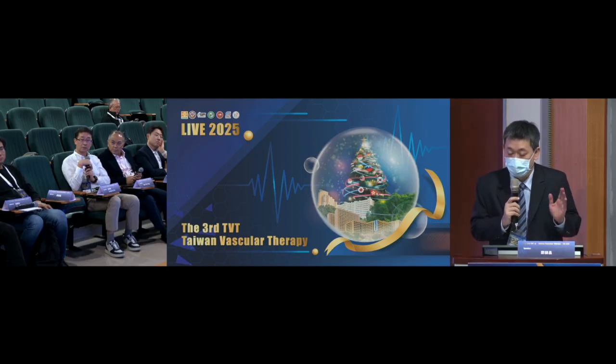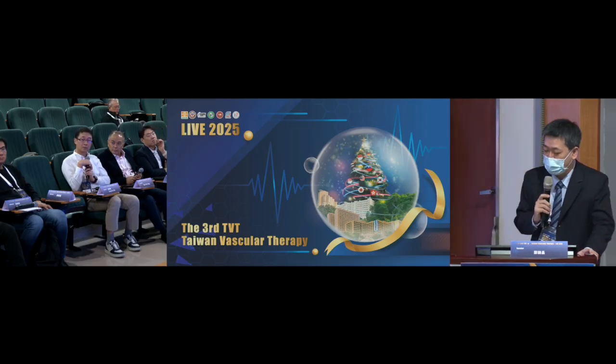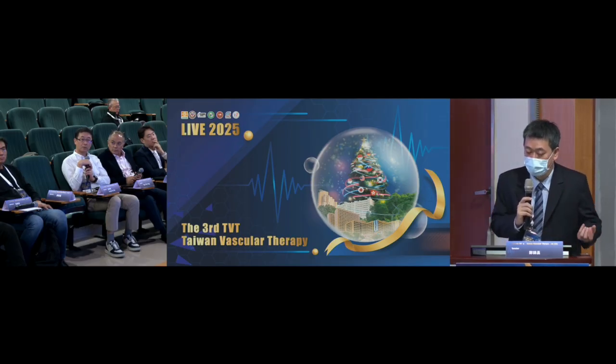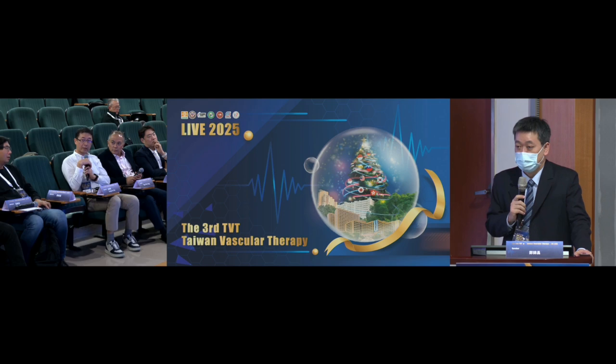I think we should treat the lesions which are not CTO first. Also, we lower the pulmonary artery pressure. Then we try to treat the CTO.